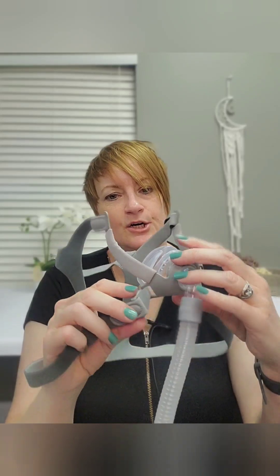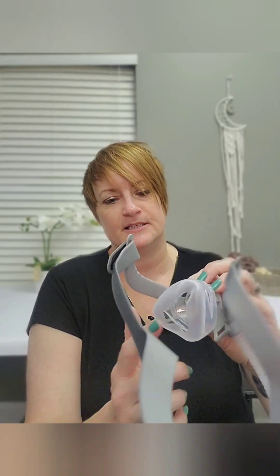This mask uses a hook closure, which is nice — it's getting harder and harder to find a non-magnetic mask. The nose piece is nice and squishy, and this accordion design looks familiar. That's nice because it takes pressure off the bridge of the nose by baffling it right there.